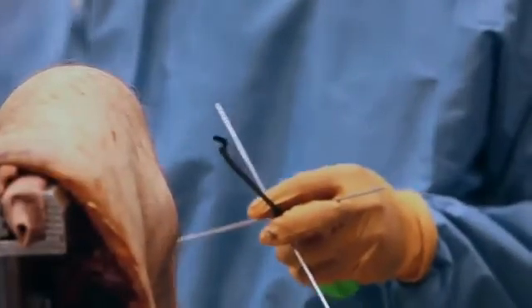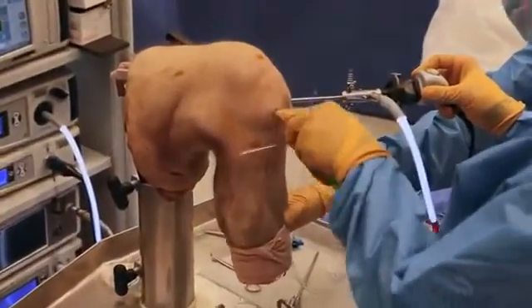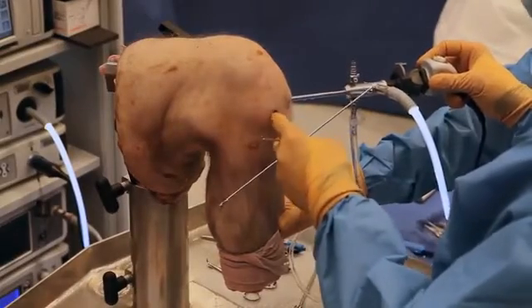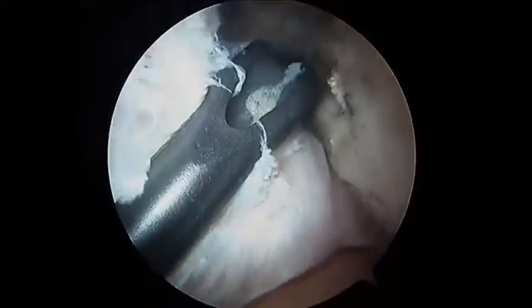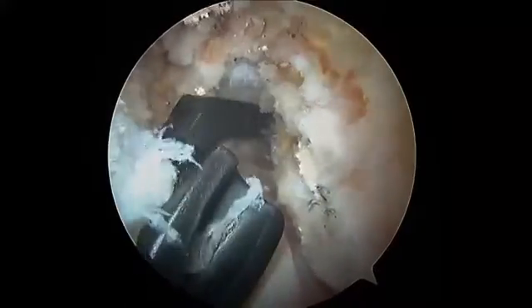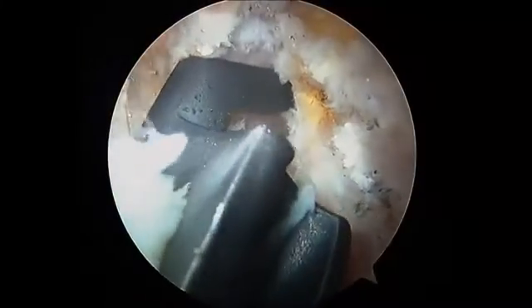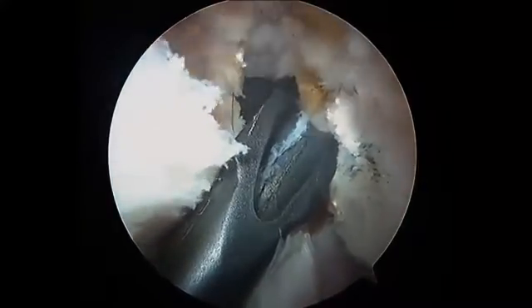So we're going to use a medial portal technique, and we're going to use this precision flexible reamer system. The real advantage from my point of view is that you don't have to hyperflex the knee, and you can do your drilling and your reaming in 90 degrees of flexion. So as you can see, we've got the precision guide system. The foot I'm going to hook around the back wall here, which I've established using my curette. You can see where I marked my ideal position. And so now we're going to put a flexible guide wire in.